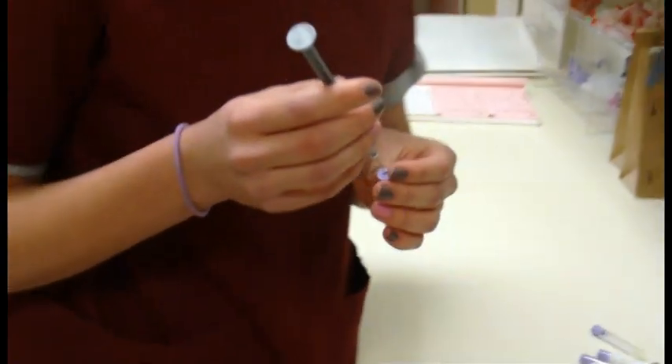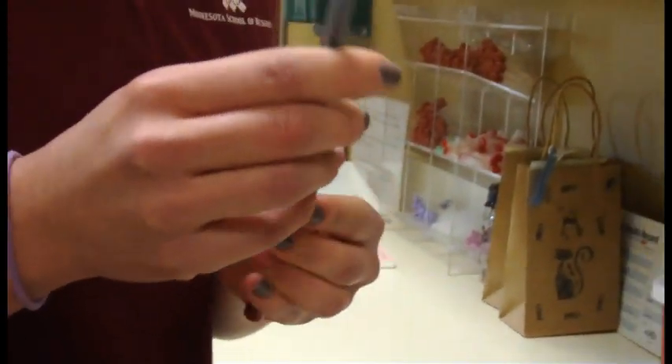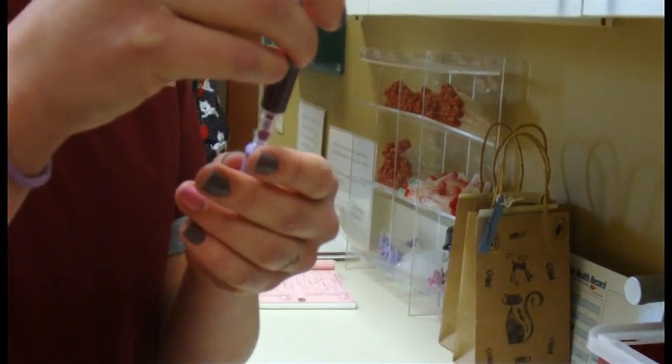Good job. And now she's going to be putting the blood in the tubes that we have used for samples. You want a half mil in the big one? Yes, please.